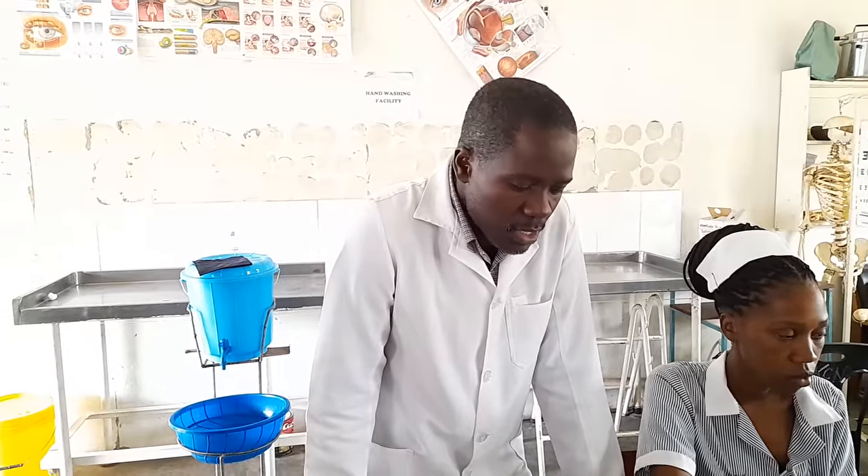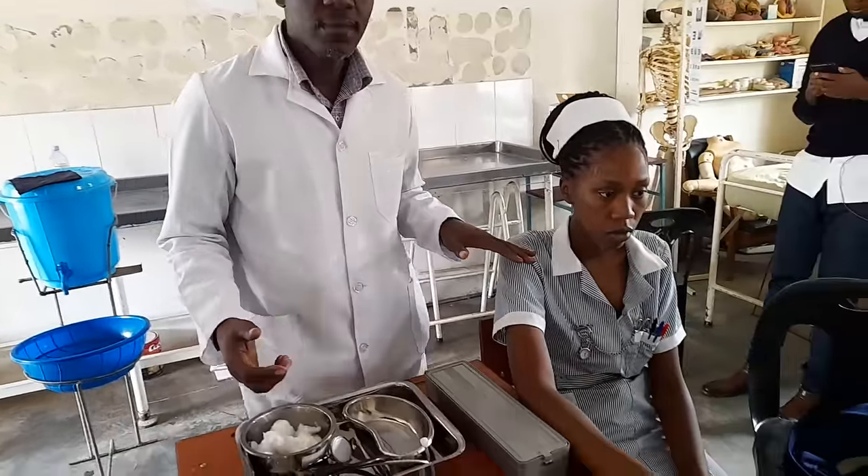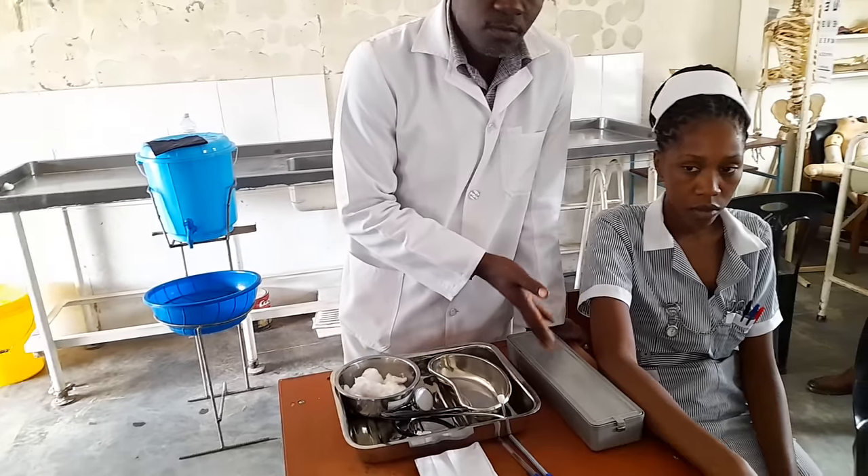Good morning, this is Mr. Sinwamba. This morning we'd like to demonstrate how we can take blood pressure using a sphygmomanometer. We want to do blood pressure because this patient here is hypertensive. If you look at the indications for blood pressure, mostly it's those patients who are hypertensive and those who have come for screening, OPD, or even on the ward — you can take blood pressure.